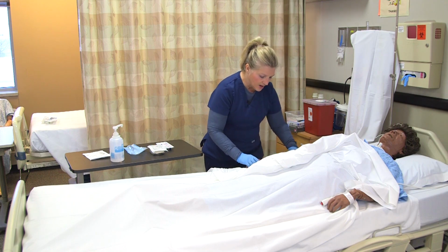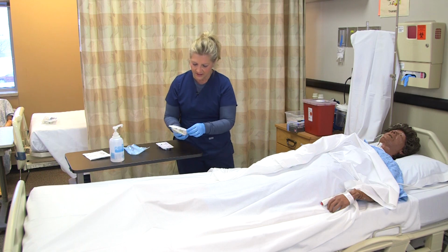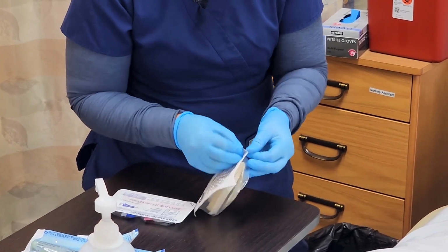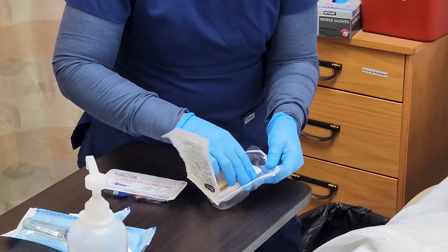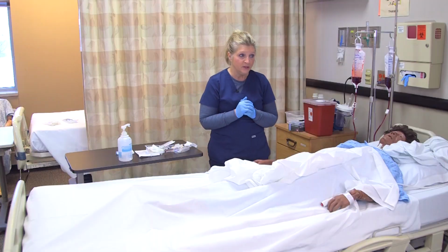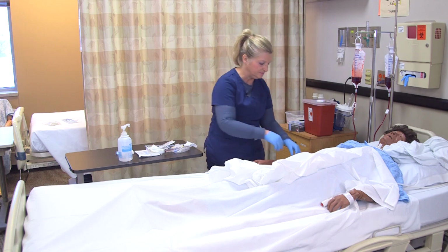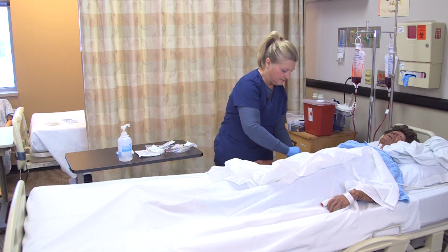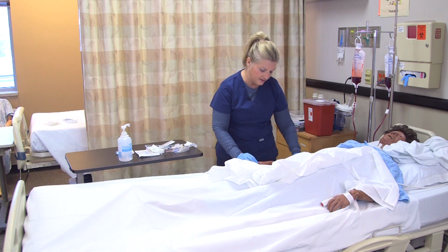Okay, so I'm looking here. I'm going to grab my tourniquet out of my IV start kit because I'm going to assess her veins. Okay, so now I'm going to find the appropriate vein that I want to use for this patient. I'm going to place the tourniquet on. Okay, and then I'm going to go ahead and examine the veins.